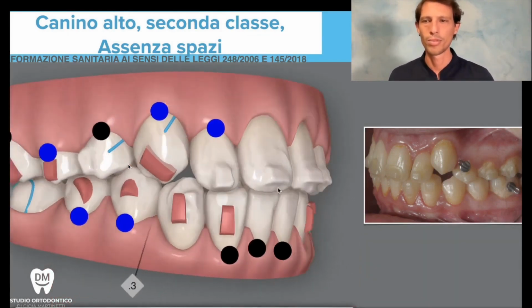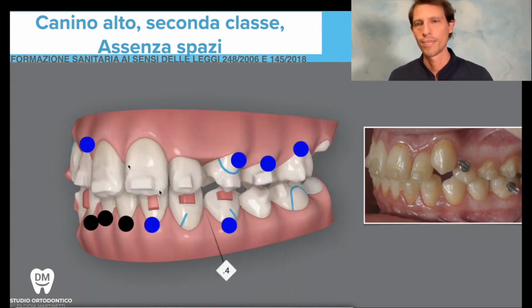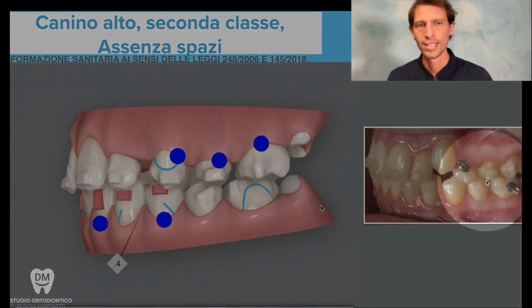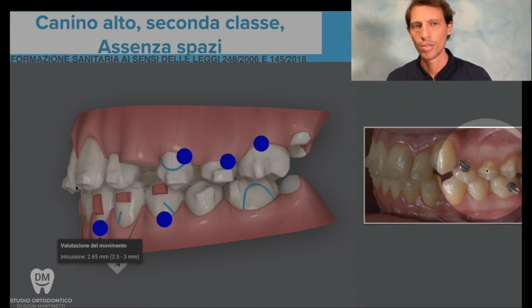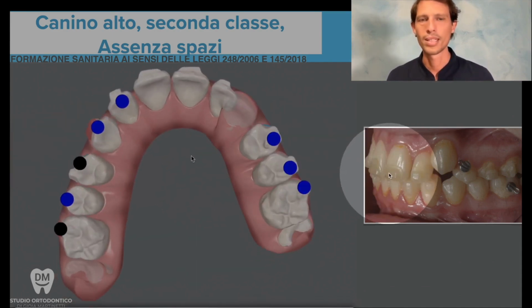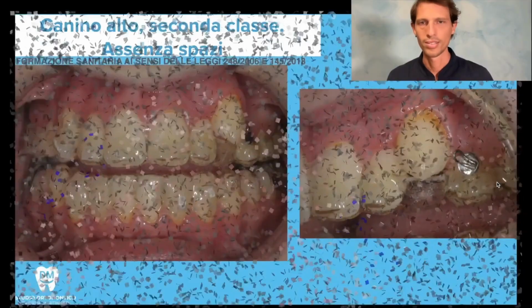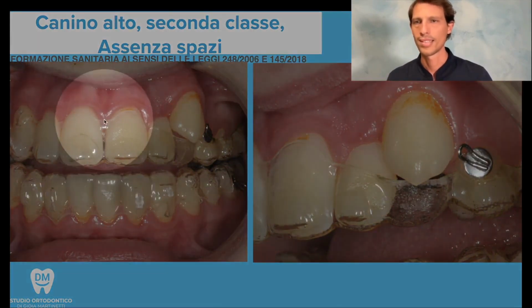This is the treatment simulation to be done with clear aligners, and we use it too. Creating space for these teeth also involves the use of elastics, which are attached to buttons bonded to the teeth. These can also be white, or to attachments, which are small drops of clear resin. Here they're shown in red, but in the mouth they're actually transparent, as are the clear aligners, which, when worn, appear. They are visible as these transparent trays with the attachments.